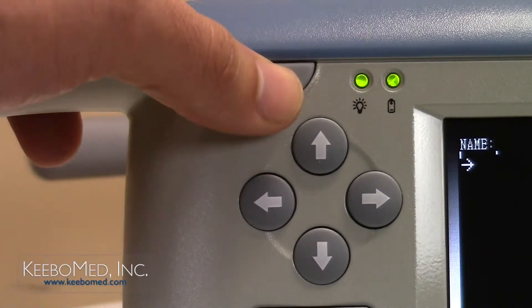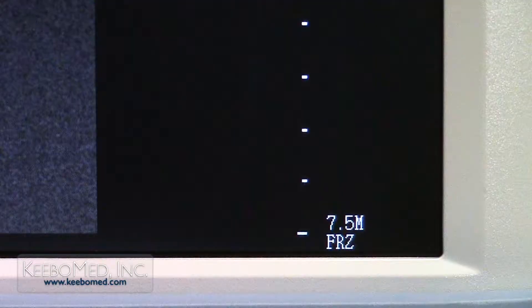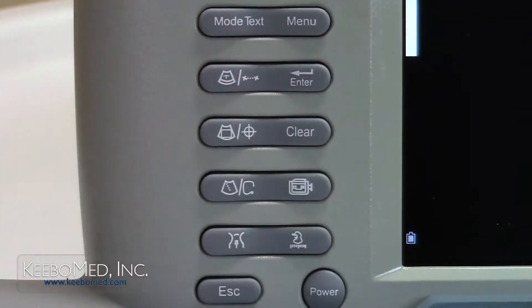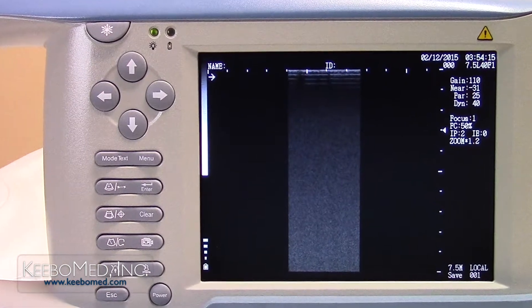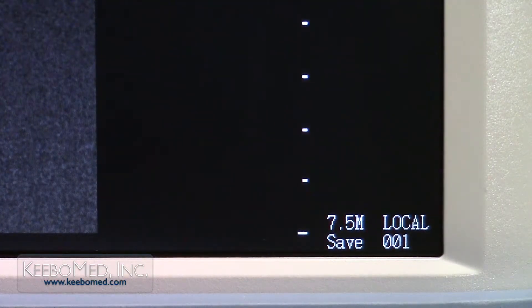Step 1. Press the freeze key to freeze the image. The letters FRZ will appear on the bottom right corner of the screen. Step 2. Press the save key once. A save prompt will now appear on the bottom right corner of the screen. The word local is also displayed.